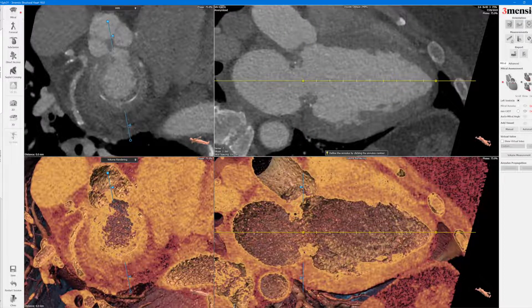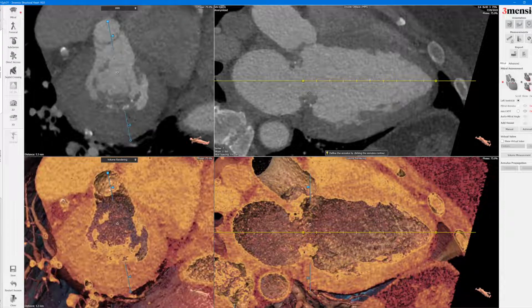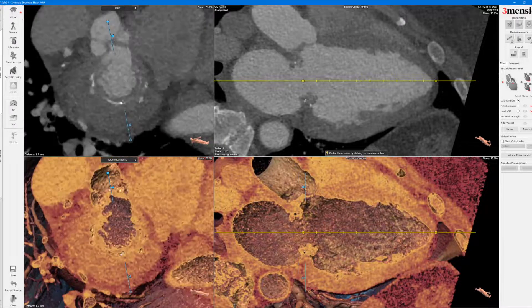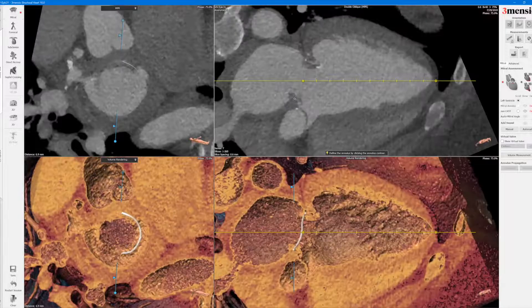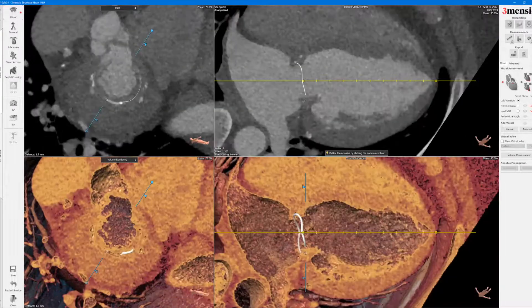The first step is to define the mitral annulus. Now this is going to be tricky because remember it's not as easy to identify unlike some of the other surgical valves. So what I do is try to identify where the frame is at the annular level — the very faint line. You can see a little bit of white there, and I'm just going to follow the white dot all around the annulus.